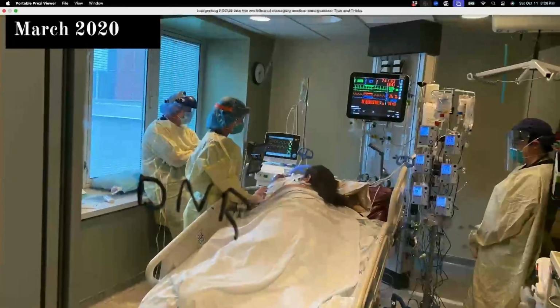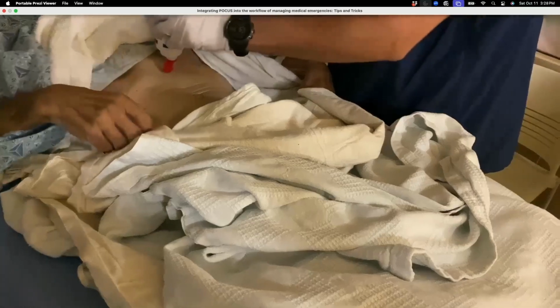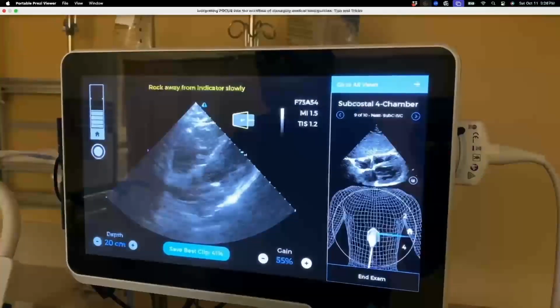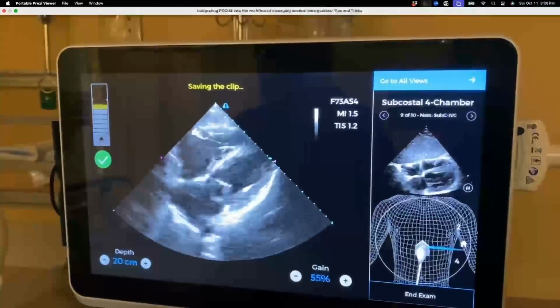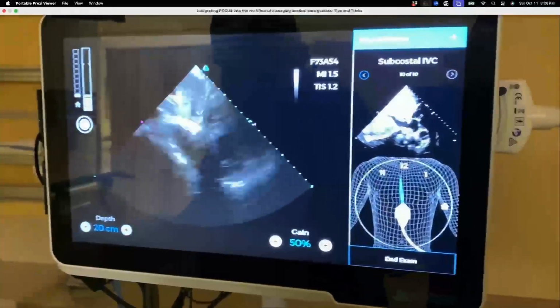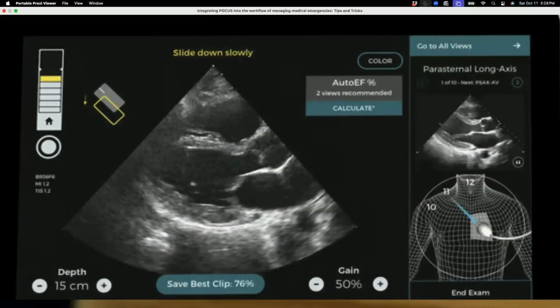So yeah, we were very overwhelmed with all the cases we got, so we couldn't really allocate 400 minutes to supervise the residents. At that time, one of the companies gave us an ultrasound machine to test it for them. It utilizes AI, more than 5 million images, to actually give 2 things. It guides the sonographer how to get the view, but it also gives an image quality assessment.